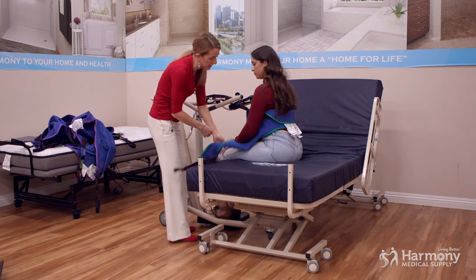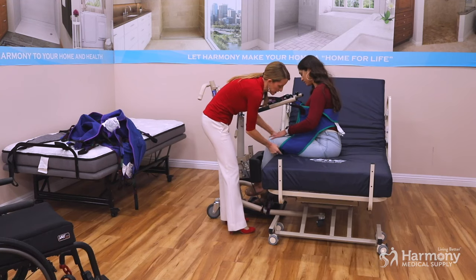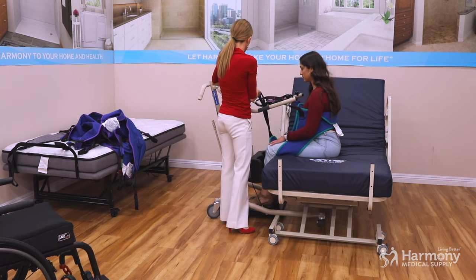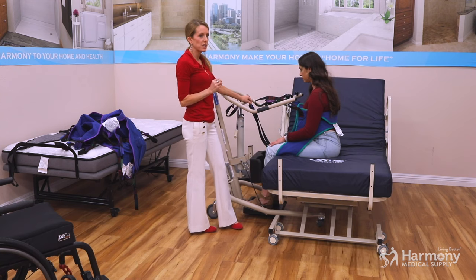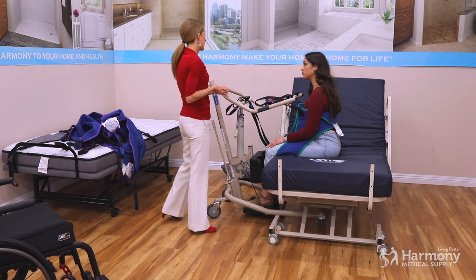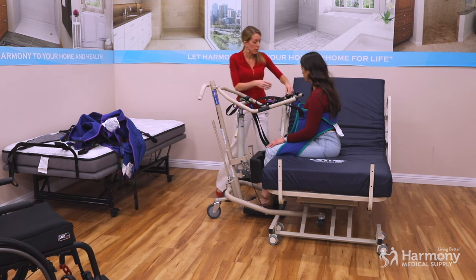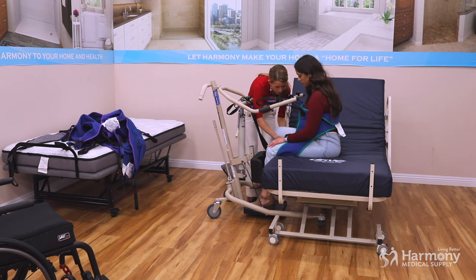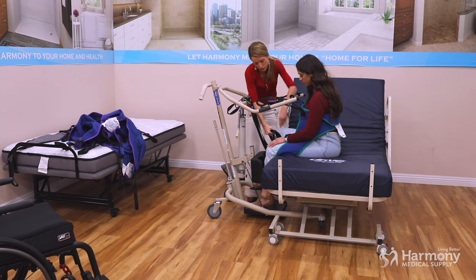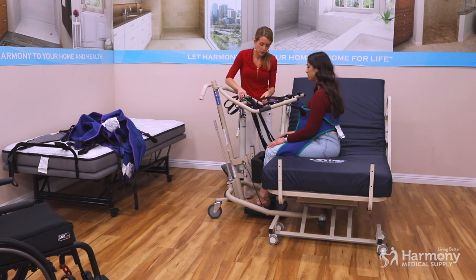This one has leg pieces — not all lifts do. We'll go underneath, just like with a divided leg sling, and attach these up here. These do a little bit of lifting, but in the sit to stand model it's more like a safety net — it's there in case their knees buckle, and it's not helping with weight bearing. So they won't have a fall and will still be held up. We bring the straps under the leg and attach, and we are good.